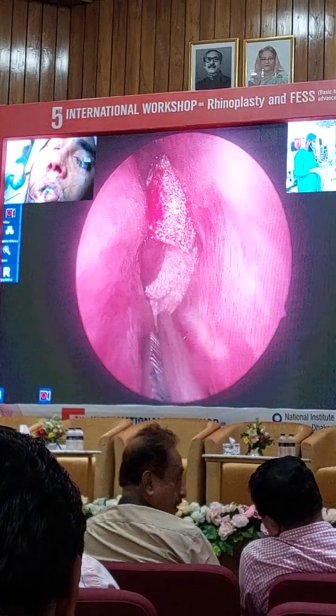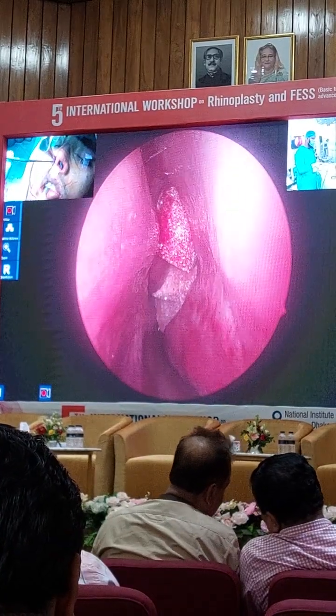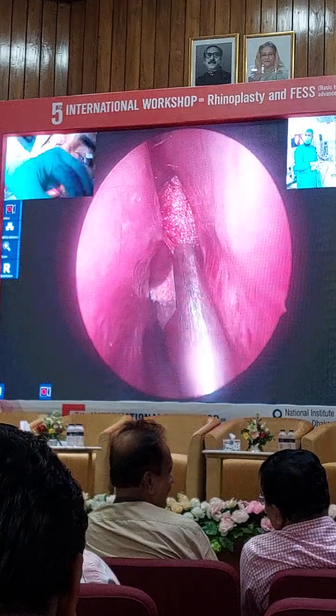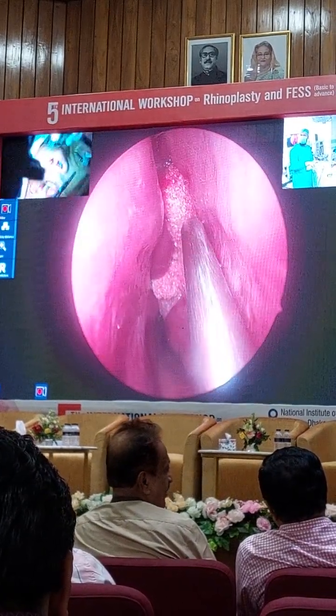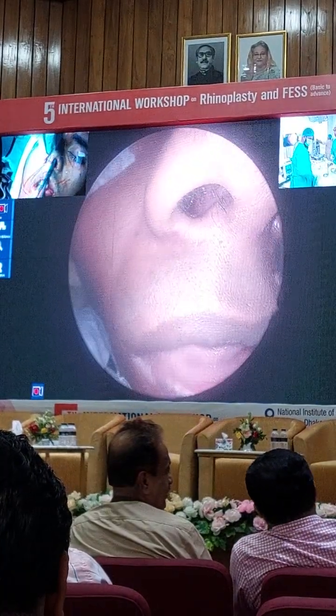Now, in a normal situation, I would go to the right side and do the same thing on the right side. So I'm not going to waste time then coming back or waiting for this hemostasis to happen. So though we haven't done the scans on the right side, let's at least look at the right side and see what we have on the right side.